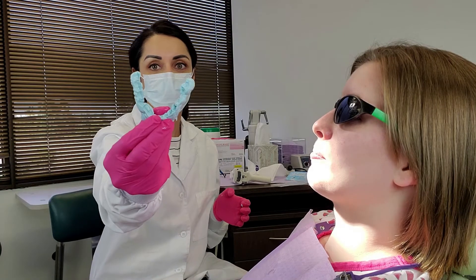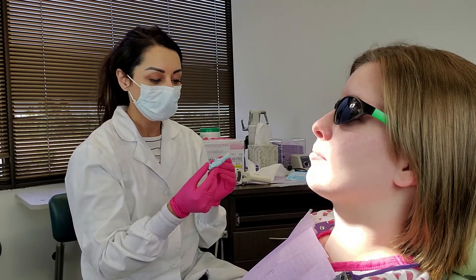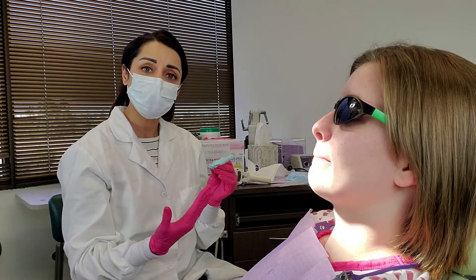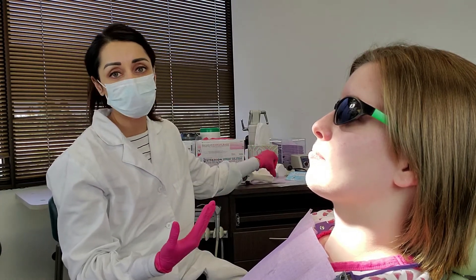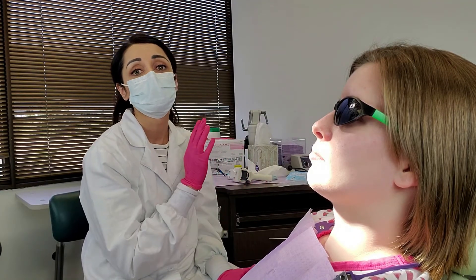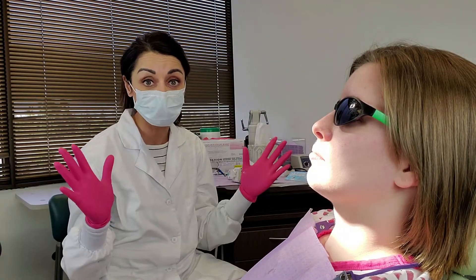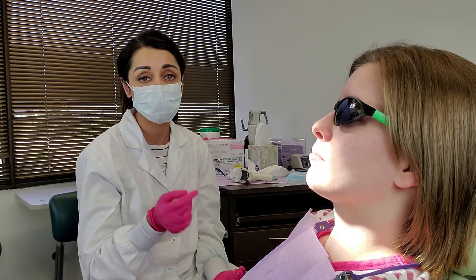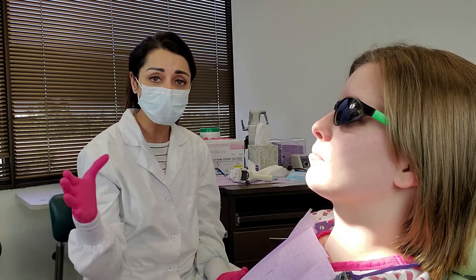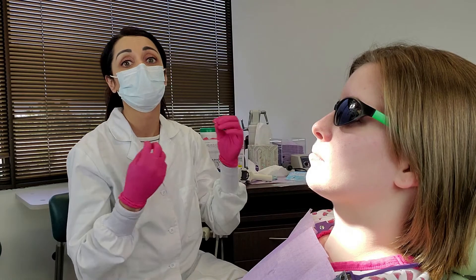Here is the final product. It should look nice and clean and have all the bite marks in it — top and bottom — so the lab can easily mount it to this bite registration. When I've done this for my patients, good things tend to happen. If you don't have a TMJ specialist in your area, this can be a really good thing you can do in your own practice. This is much, much better and more superior to replicating the natural bite — that's why the Aqualizer Bite is so valuable. It actually puts the muscles in their happy place, instead of just putting plastic between the teeth to block the forces of clenching and grinding. This does more for the muscles, joints, and ligaments, and also protects the teeth.